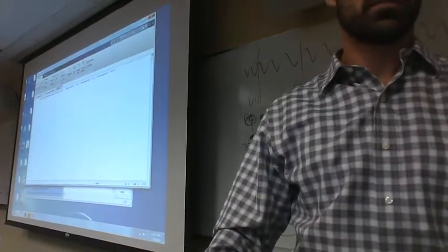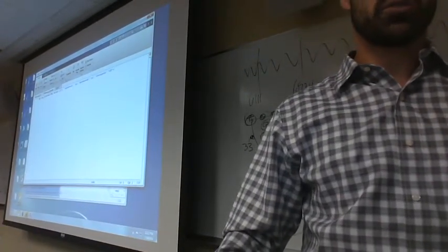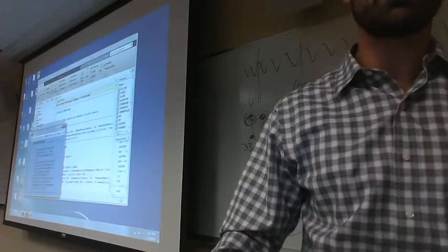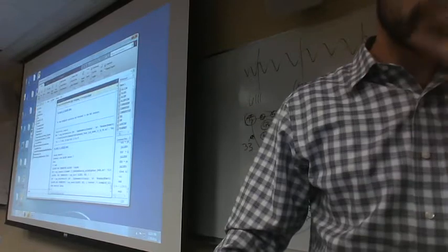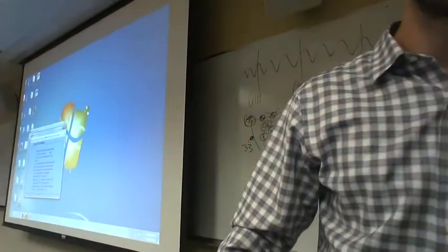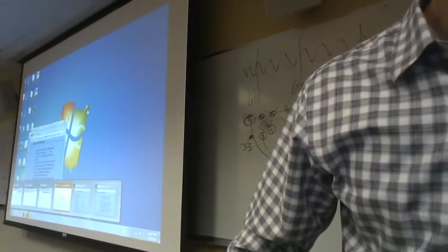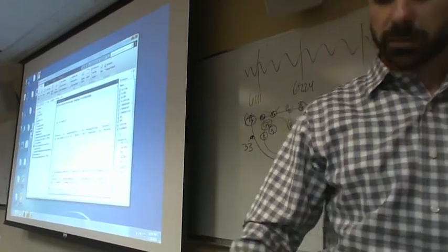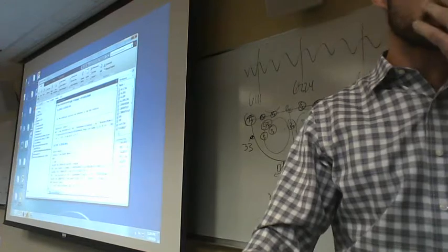And I'm just going to copy that, and we can put that directly in our main MATLAB window that we're working in, which is here. I paste that in and just hit enter, and it runs.